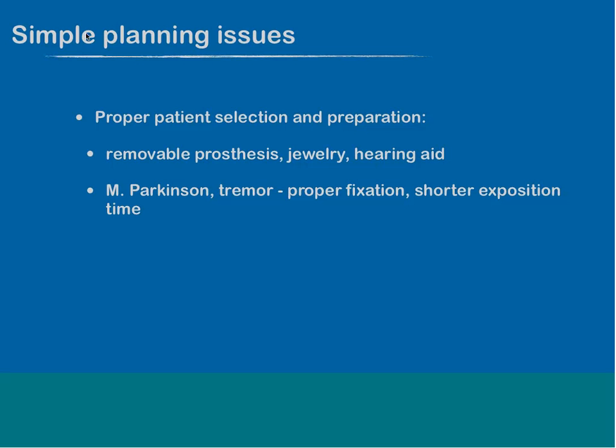And if it is possible with your machine, you have to check for a short exposition time, because the longer the exposure needs, the more time the patient has to move. We observed in the past, when the machines needed a long exposition time, more patient movement than today, where we see exposition times below 10 seconds or even shorter.